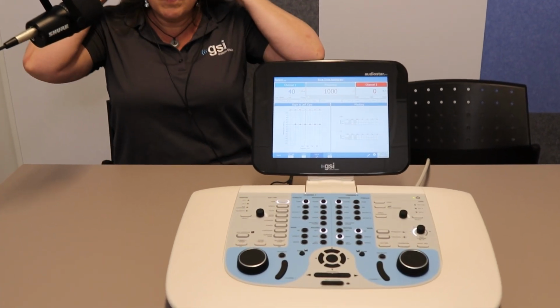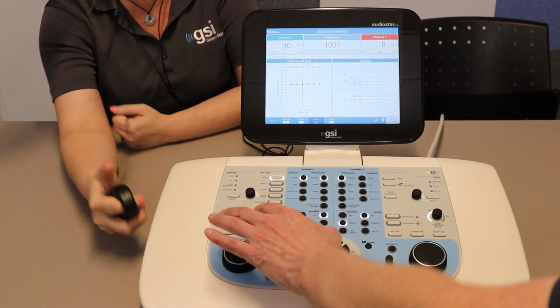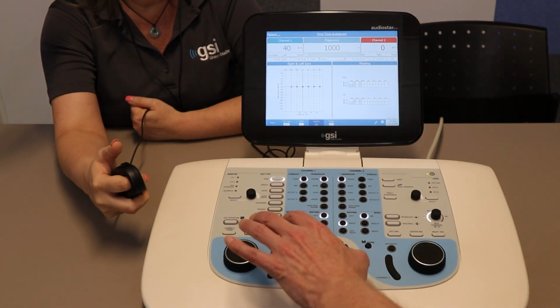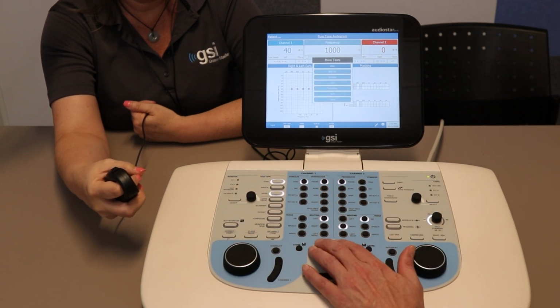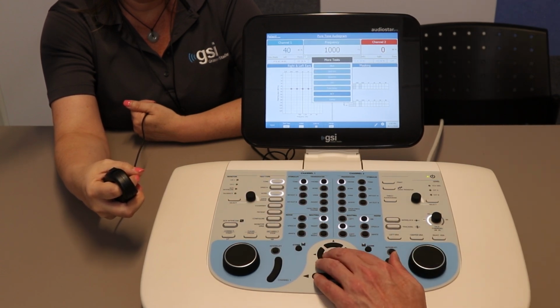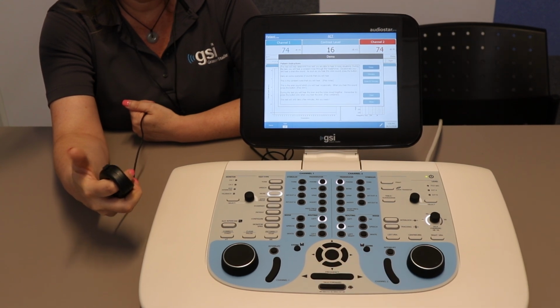So what we're going to do first is navigate to the ACT test. You can see here we've got our audiogram already filled in. And Laura, we just gave you a flat 40 dB hearing loss to make it really simple. So I'm going to press the More button, which allows me to access all the additional tests on the device. I'm going to hit ACT, and that's going to bring me to this screen here.